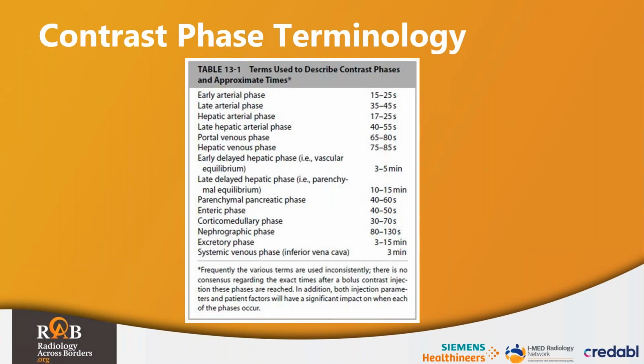So contrast phase terminology does vary. It varies a lot between sites, between radiologists, within the practice, and in what a doctor considers. So it's really important to clarify exactly what the referring doctor means, what the radiologist means, so we can get specific on timings and everyone's on the same page. Like it says down the bottom there, the various terms generally change quite a lot between each of them, but these are some general terms that are common practice and everyone is in agreement on.